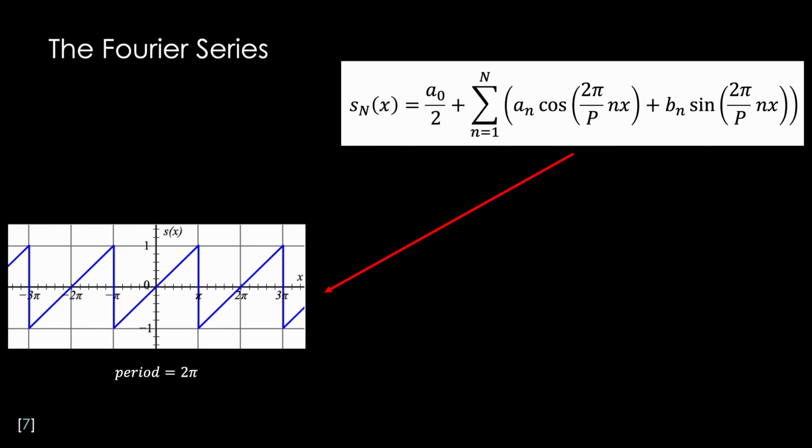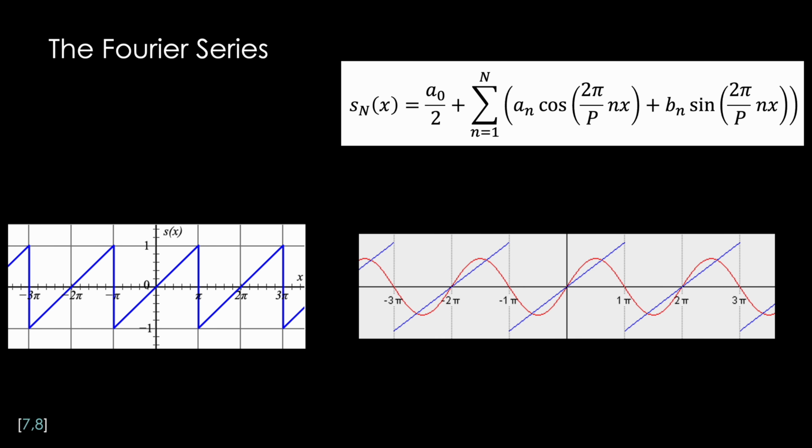Let's take a look at this visually. The blue lines on this new figure represent our function on the left, and one by one we'll add these sinusoidal waves together using the above formula and see what happens. As you can see, the more we add, the closer this approximates the original function. In this example, our n equals 5 iterations of the above formula.